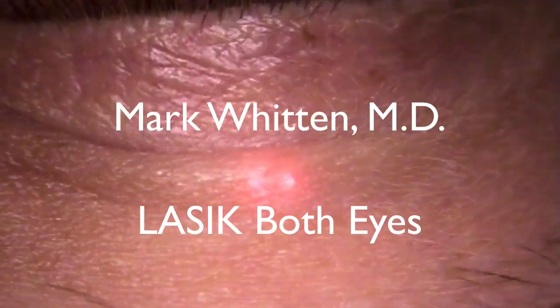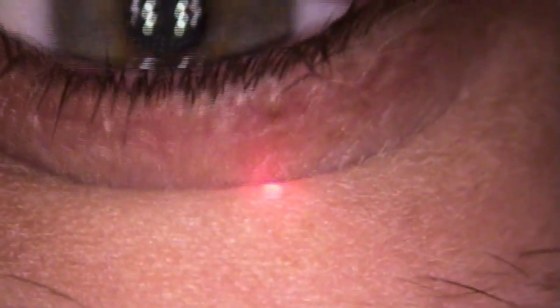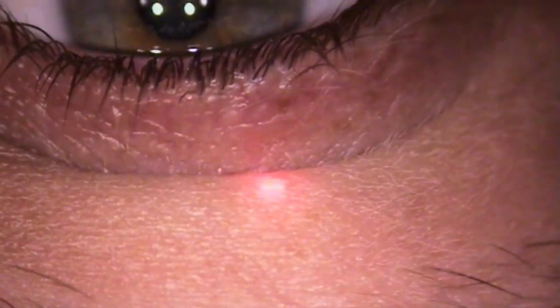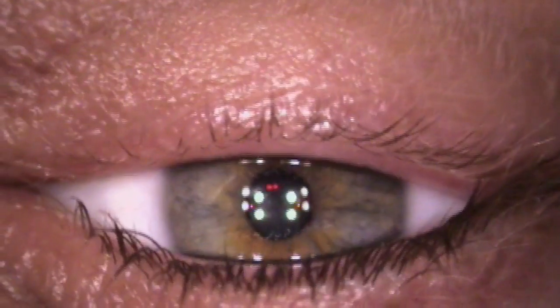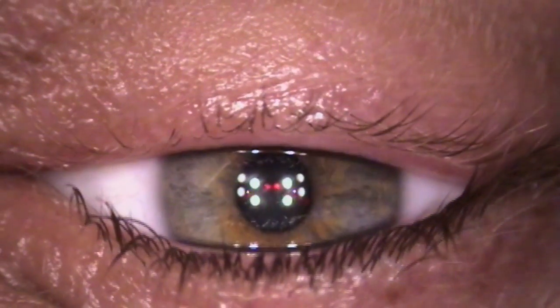I'm going to put some extra drops in. Mostly what you're going to experience is just me pushing on you, just like that — a little bit of pressure. You're not going to be able to see very well for about 10 or 15 seconds, but no pain allowed today. Look right up at that green flashing light. That's your target, that's your friend today.